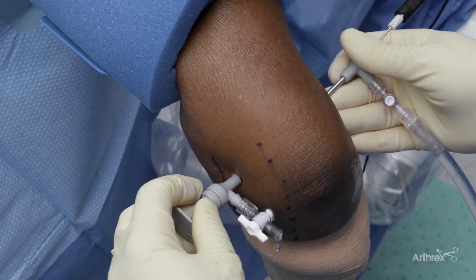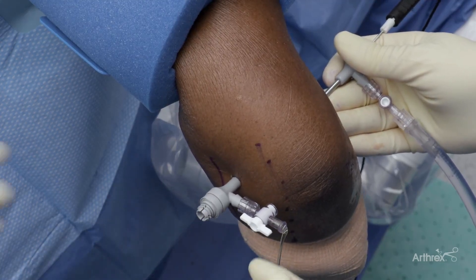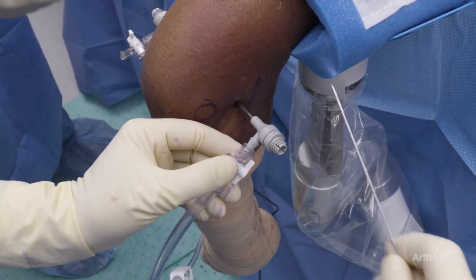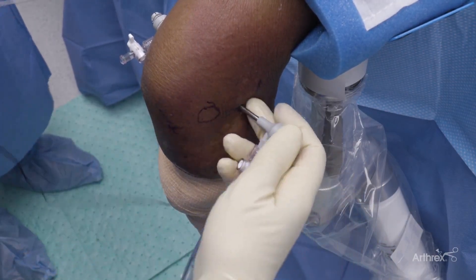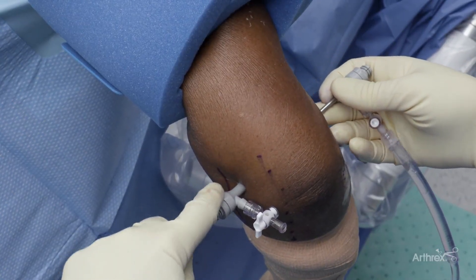I'm going to switch from the radial portal into the ulnar portal, leaving this cannula in place so we're not having to shift cannulas — which is very important in small joint work when trying to deal with flow. Now looking at the radial side, you can see the capitellum and your radial head. I'll just rotate the arm — you get an excellent view of your radial head. And if you look straight down, you can often see the annular ligament.